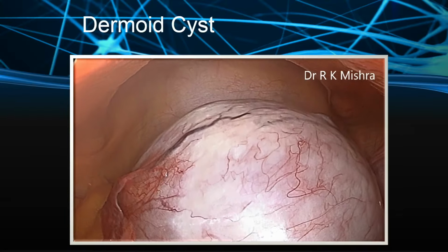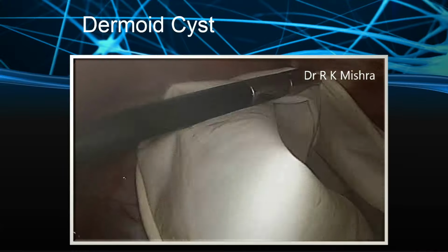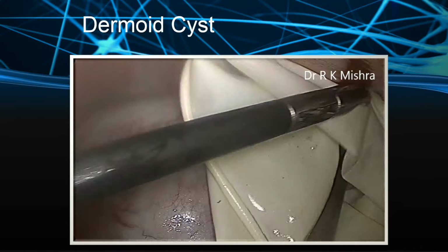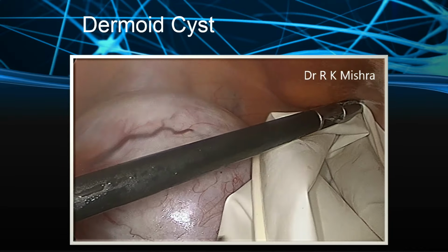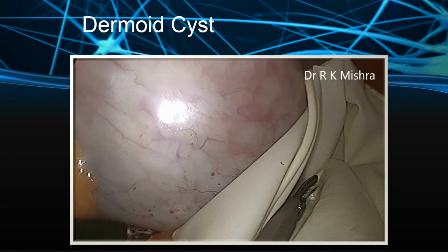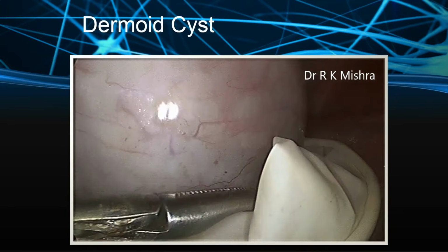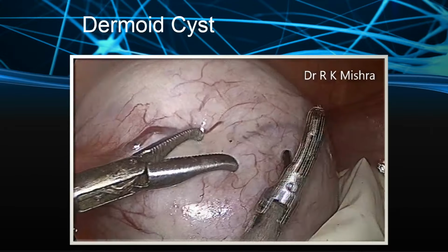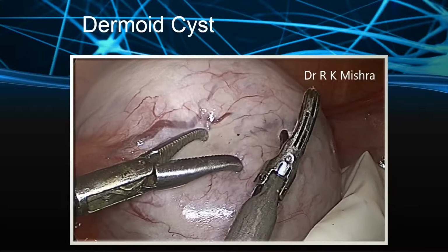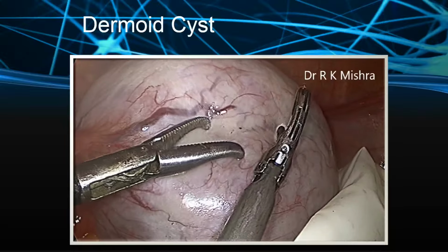So, what you will do, again you will go with the harmonic, you put in an endo bag, so that people will be happy that you are taking some measure, but it is not guaranteed that the fluid will obey your command to enter this endo bag. It will go wherever it wants, is it not? I cannot force the content, saying I have kept the endo bag, why did you go there? But our precautions should be there, and knocking with the harmonic you can do. These are the beautiful effects of the harmonic, which is not present in any instrument.